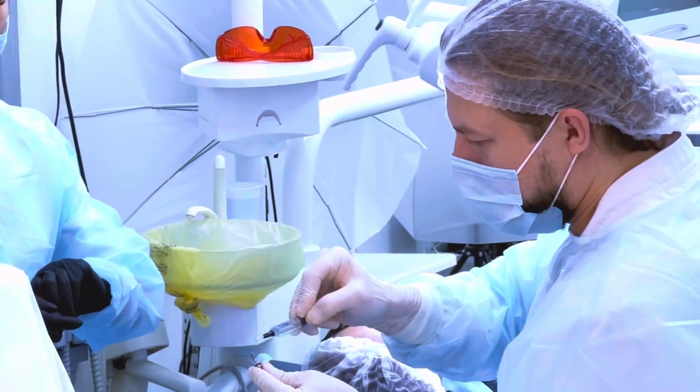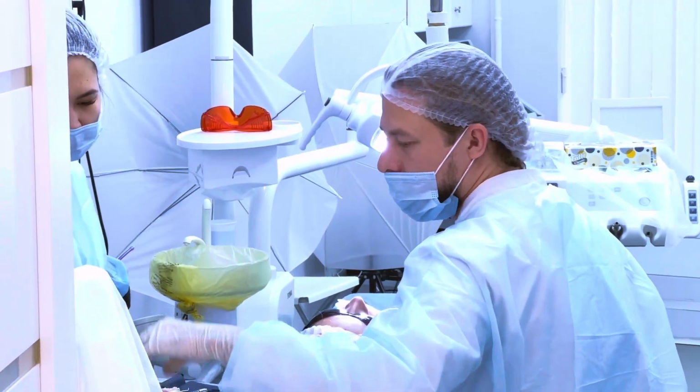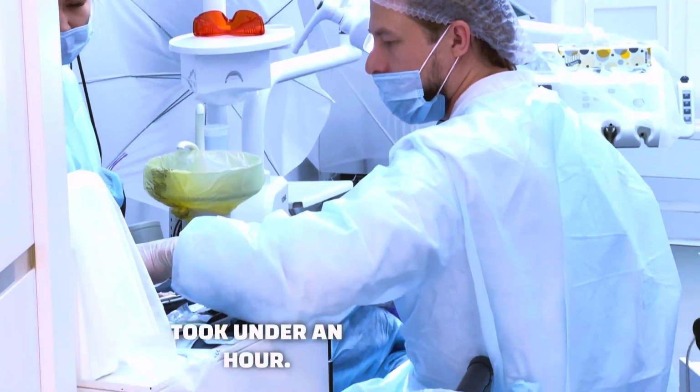I typically moisten the implant with cool saline before installation. We're done with this side. Everything's fine, and it took under an hour.